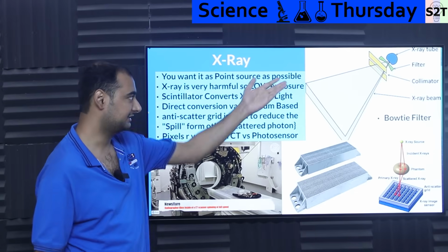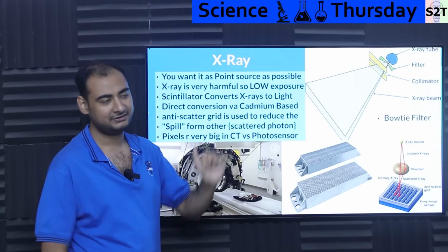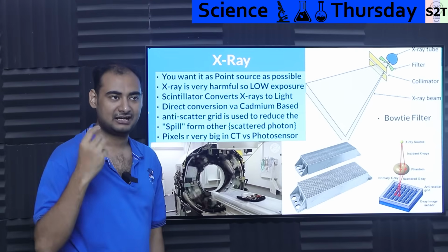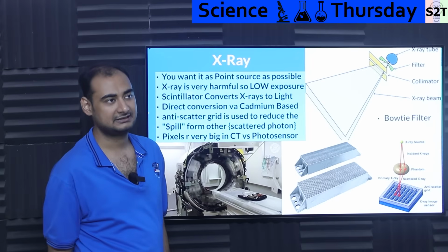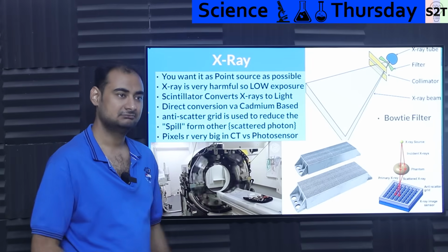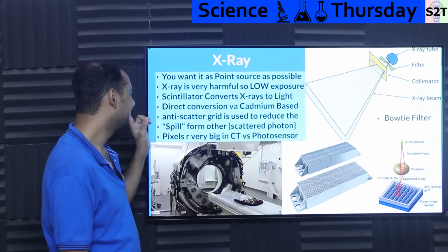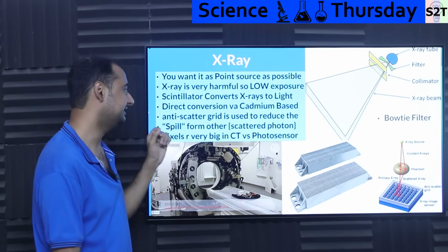And after that, the X-ray is emitted, gone through your body. It was emitted with 100 oomph, now it went through your body, and now it has 2D data, where it's like where I am and how much I lost. Basically, it came with 100 oomph, it only dumped let's say 70 in your data sensor, you're like, okay, 30 was lost. That's how you create that sinogram. And then how the heck do you detect it? Well, you detect it via what we call a scintillator.